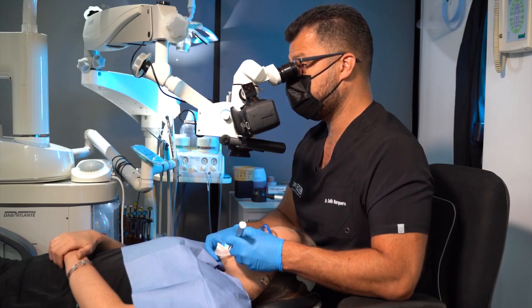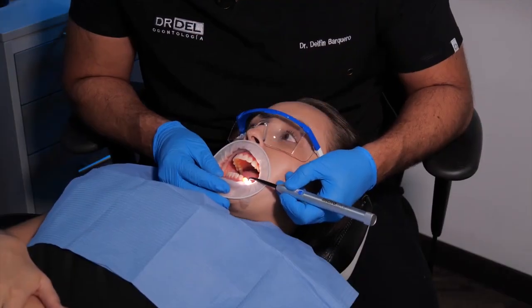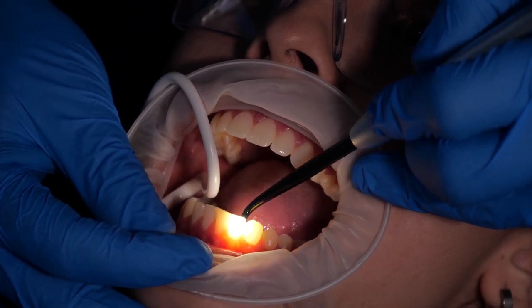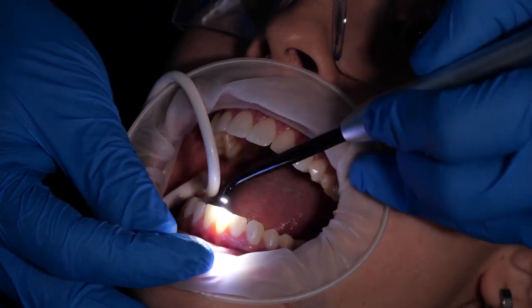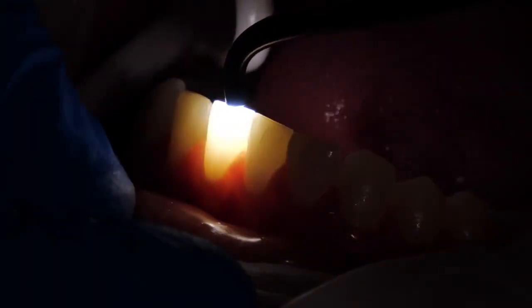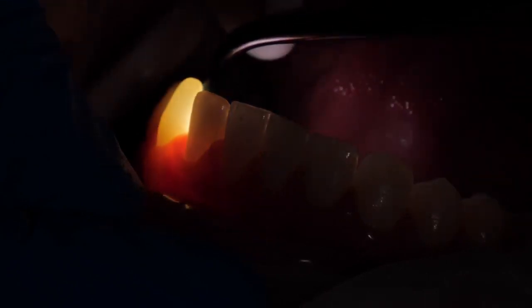Sometimes x-rays are not enough and we need to use a device that is going to tell us with light if there are fractures. It's very easy to use. It's very easy to see those fractures when this powerful light goes through the tooth. So for my patients and for me, this is a must-have tool.